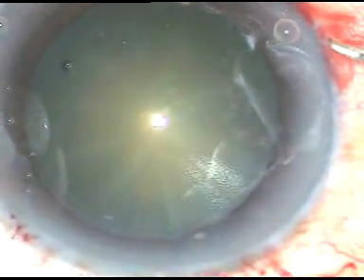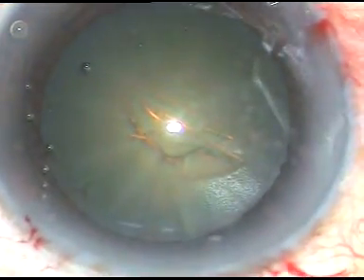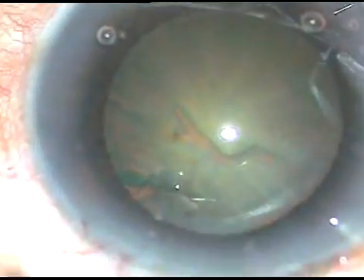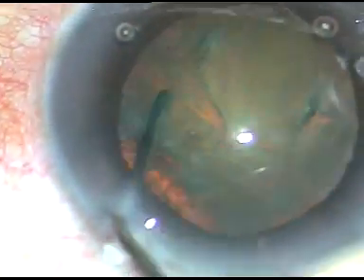In divide and conquer technique you are making your sculpting and you are always afraid how deep you should go. Here you don't have that fear — you just have to hold the nuclear mass with high vacuum and chop it. The chopper I use is only 0.5 millimeter, and you can easily get choppers between 0.5 to 1 millimeter. Since the nuclear mass in the nucleus is about 4 millimeters thick, there is no way that you can pierce the posterior capsule with your chopper. So just hold the nuclear mass with high vacuum and chop it.